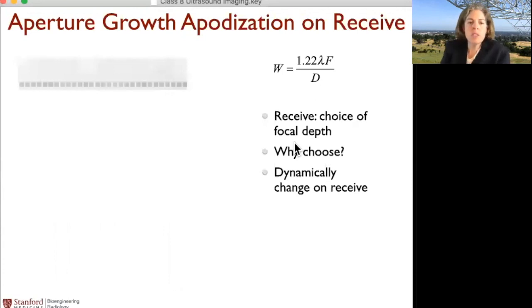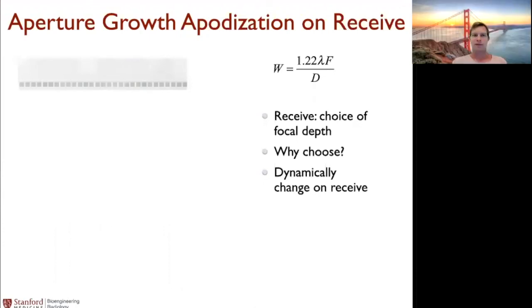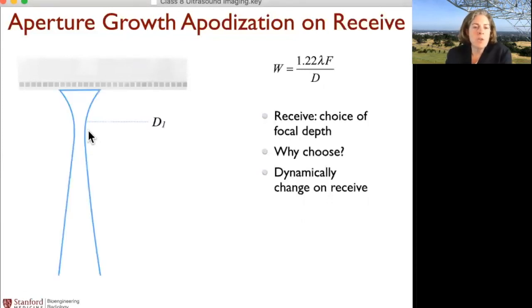Okay, so this is really cool. This is similar to what we saw before, where we applied those same concepts on transmit in order to get beams; now you can apply those concepts on receive. You've already sent out a beam, and now you're going to receive from an area that has this sort of sensitivity, so these are the elements you're going to listen to.